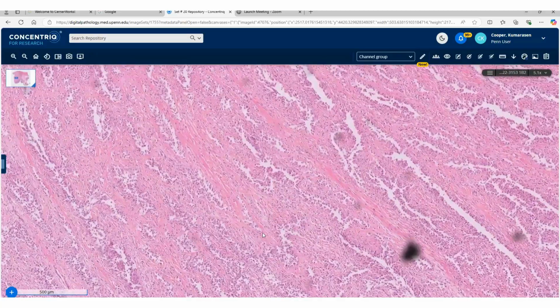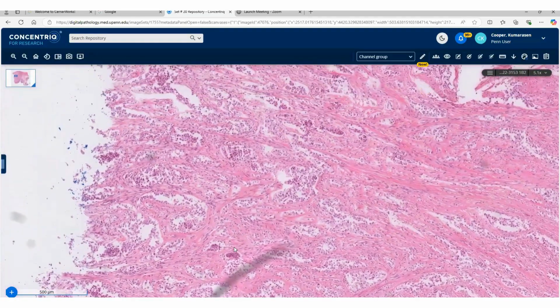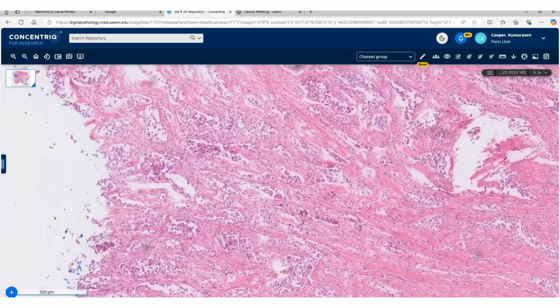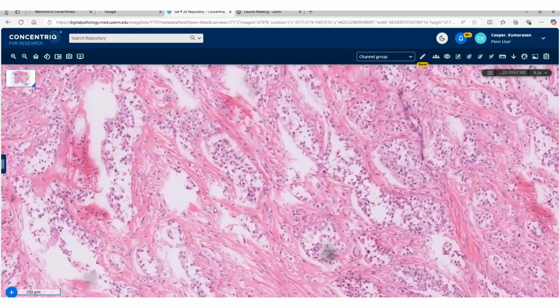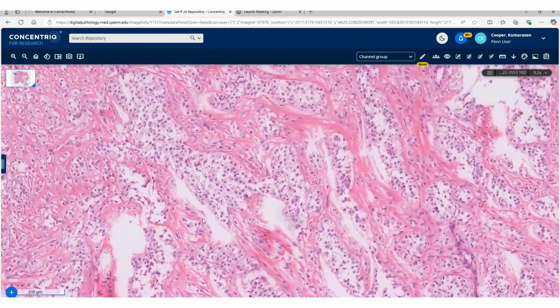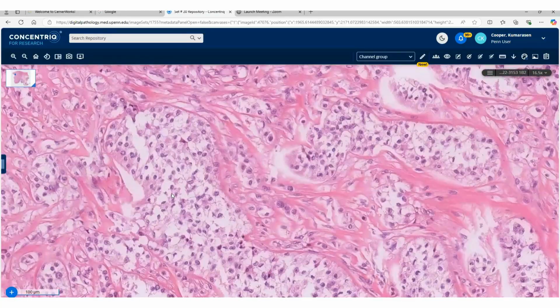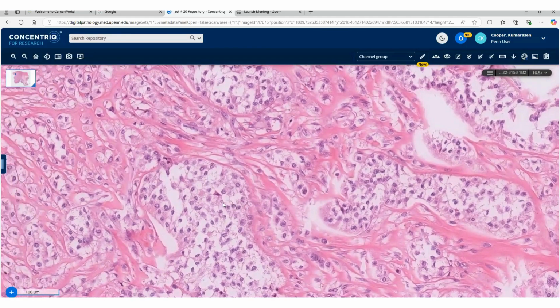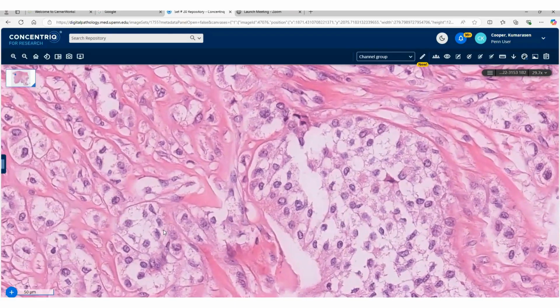That's pretty much the architecture and pattern as we extend all the way through into the muscularis propria, where you can probably see more solid trabecular pattern. Like I was saying, it was artifactually arranged in the submucosa. Here, just probably a better variation to these larger trabecular bars. You can see these cords and nests here. Just to give you a high power, that's pretty much the arrangement in cytomorphology.